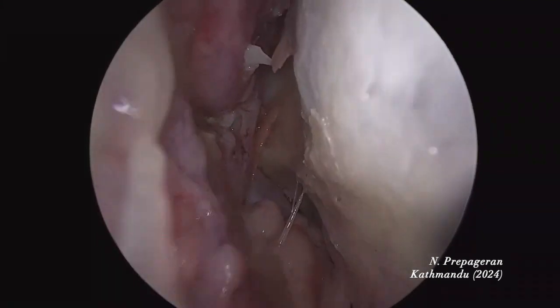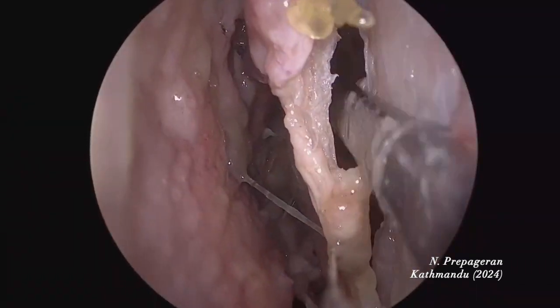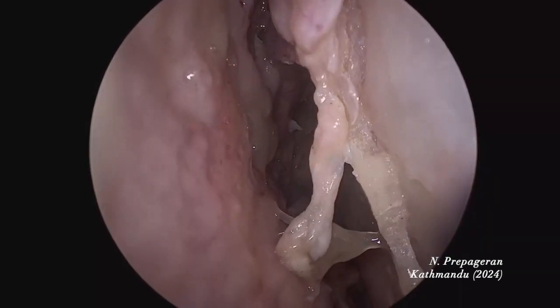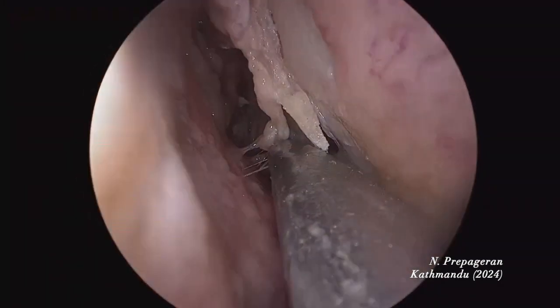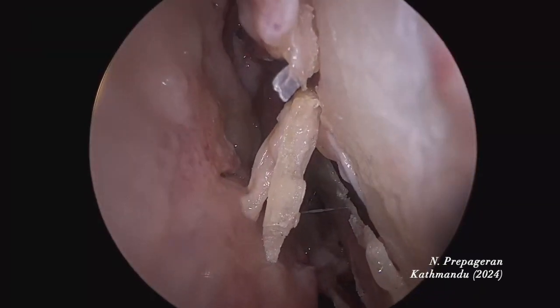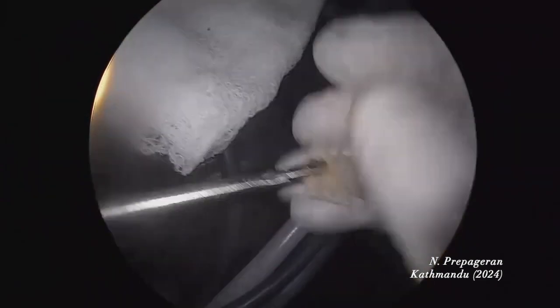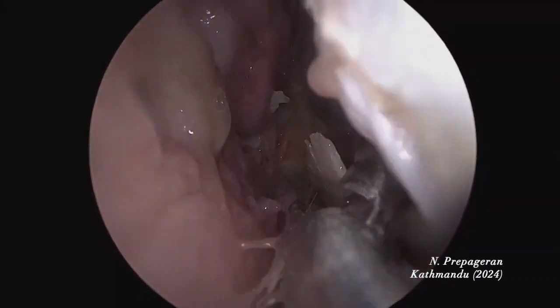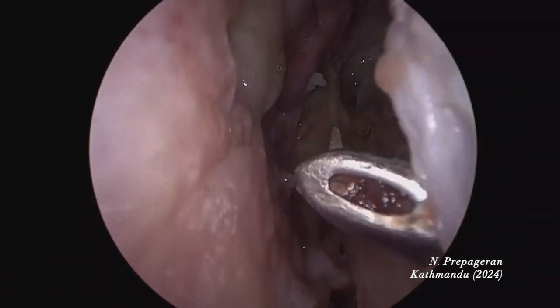The flap has been raised all the way down. The next step is to remove the cartilage and the septum in between. I'm going to cut and remove the cartilage of the septum — this can be used for reconstruction. Let's look at the septum that has been removed; we can use it for reconstruction if required. Now we have double nostril exposure and I can use both nostrils.